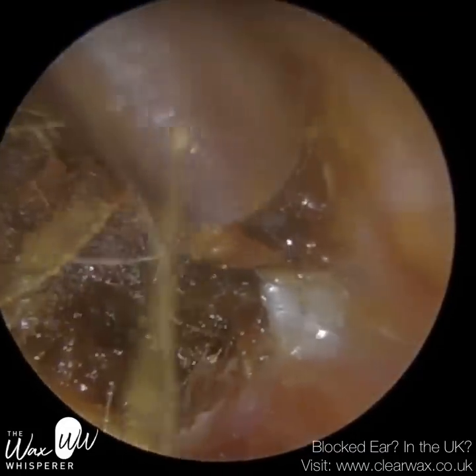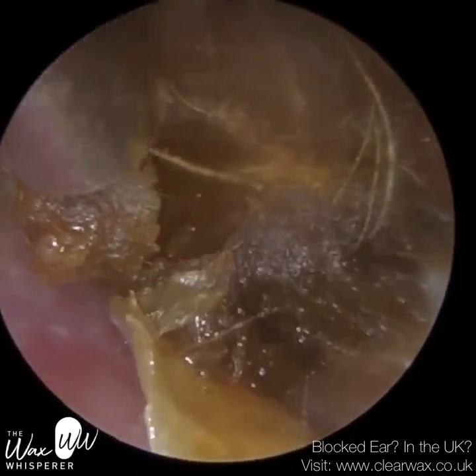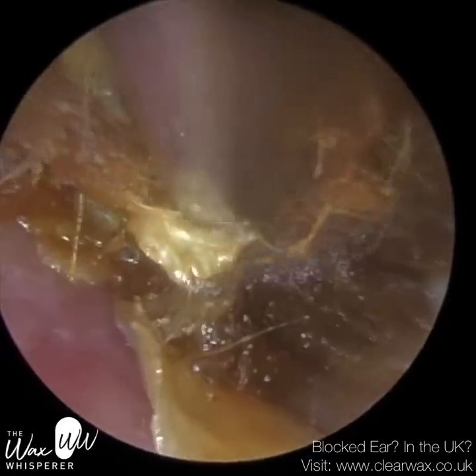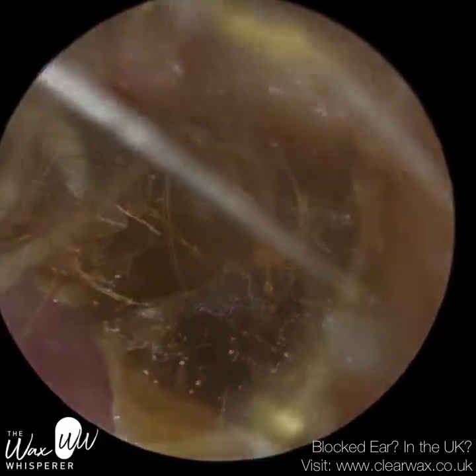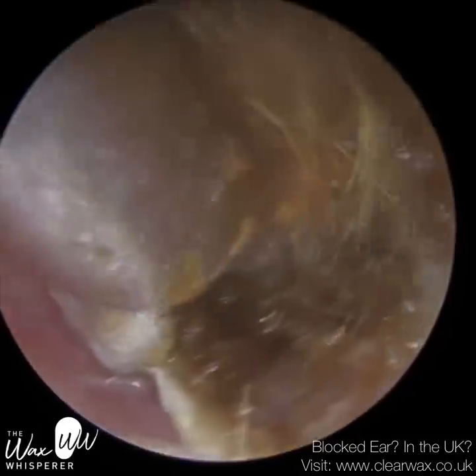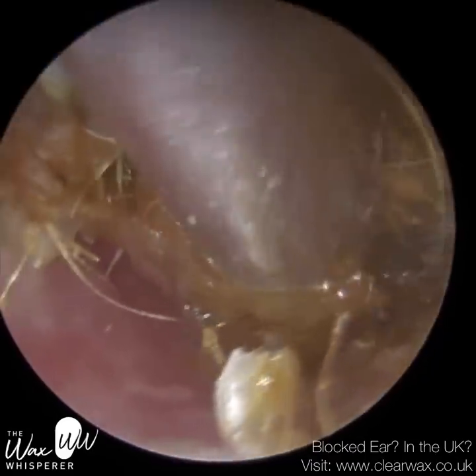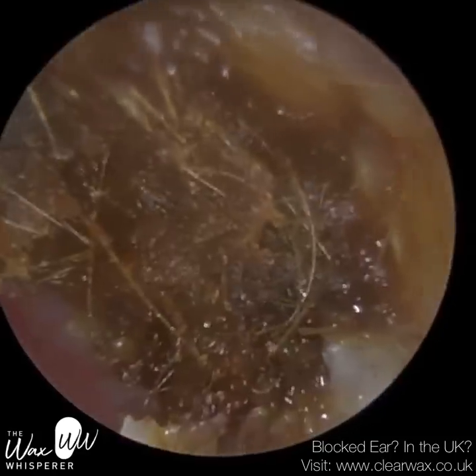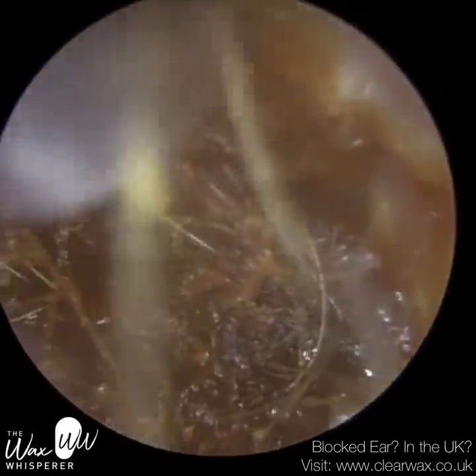One of the hallmarks of keratosis obturans is ear pain. The patient did have a bit of pain on this side, and that pain is due to how much pressure the plug is forcing against the canal wall — so much so that it can begin to change the shape of it. Grade one keratosis obturans is when a patient attends with a bit of earache but there's not necessarily any visible widening of the ear canal. Grade two is mild pain with visible widening. Grade three is moderate pain and moderate expansion, and in grade three you also get some granulation tissue.